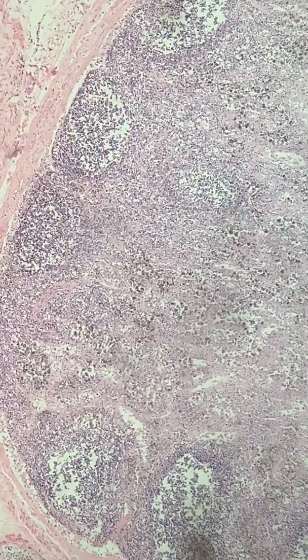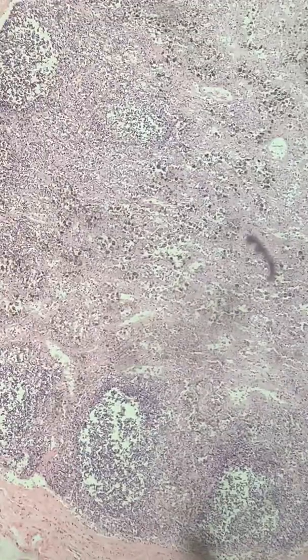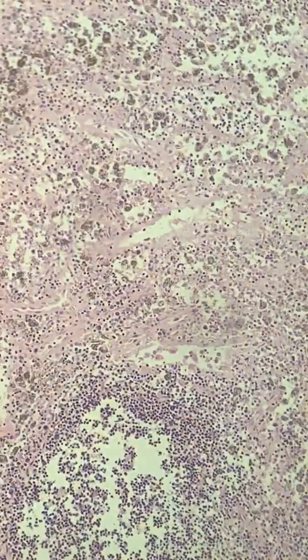But the follicle germinal centers look like they're kind of involuted. In other words, you don't see the mantle zone with it. You see just basically the germinal centers. And there's some scatter. And that goes with the pathology now of this Covid-19. It affects a certain population of B lymphocytes. So this is good pathology, man. This is really good pathology.